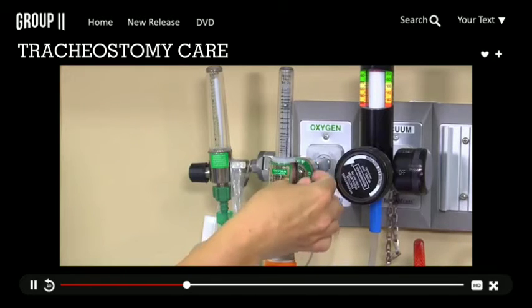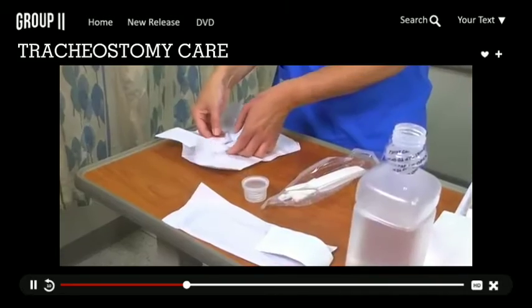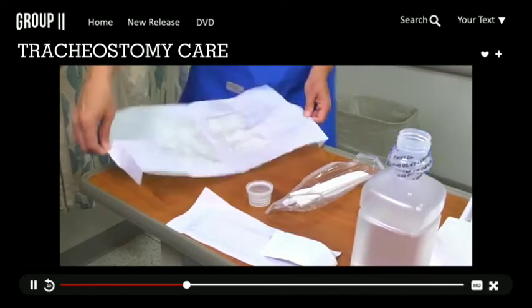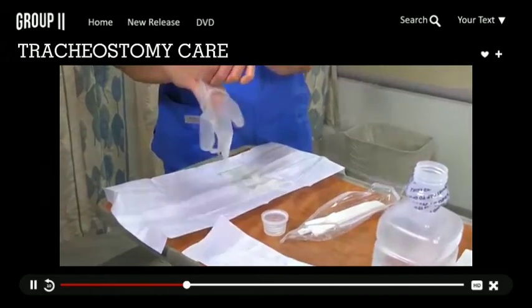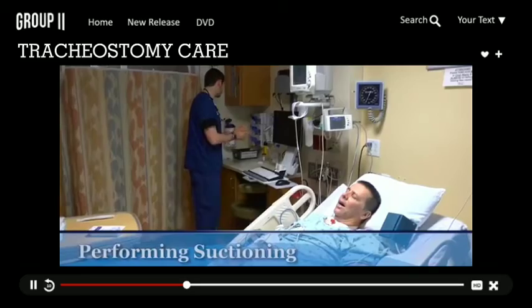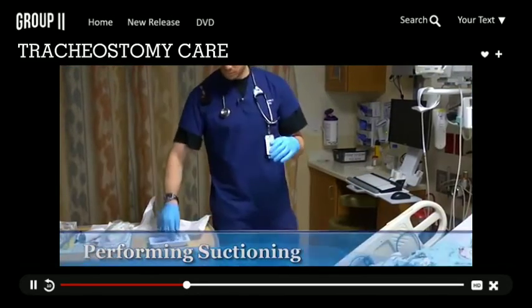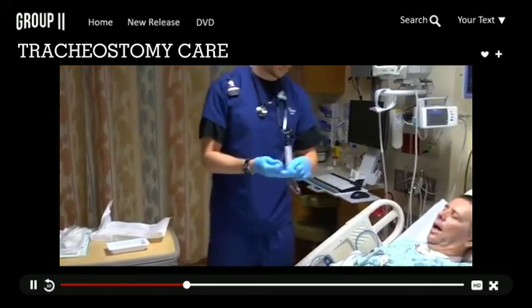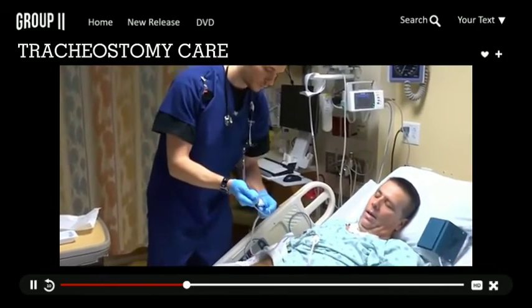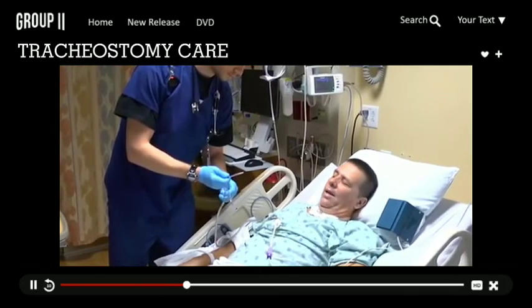Now hyperoxygenate the patient by adjusting the ventilator settings or by increasing the oxygen rate. Apply sterile gloves for suctioning. Remember, you'll need to keep your dominant hand sterile throughout the suctioning procedure. A patient with a tracheostomy sometimes has excessive peristomal secretions. To look for such secretions, apply clean gloves and a face shield if needed. Examine the tracheostomy site for soiled or damp dressings. Then suction the tracheostomy carefully to remove mucus.